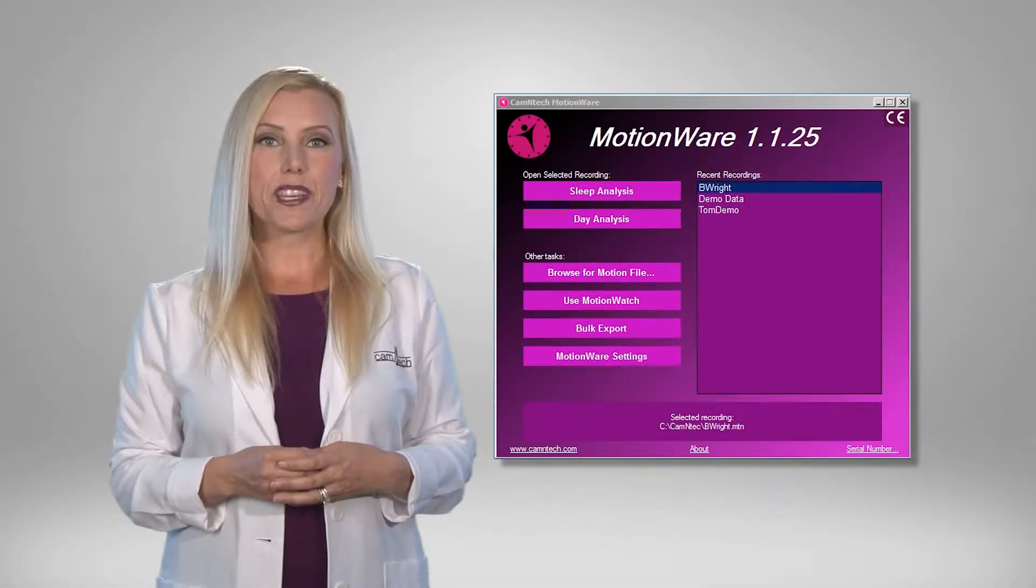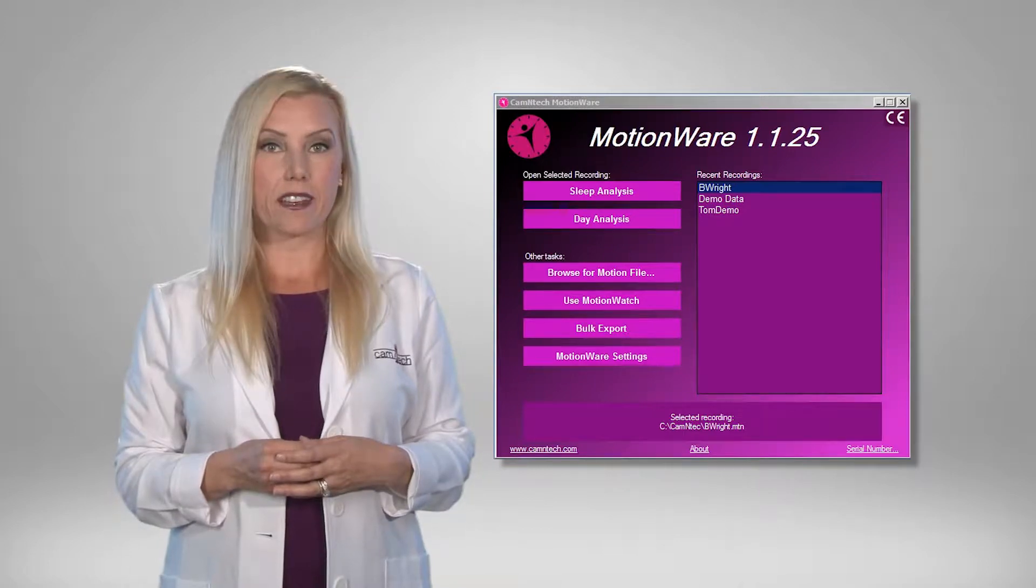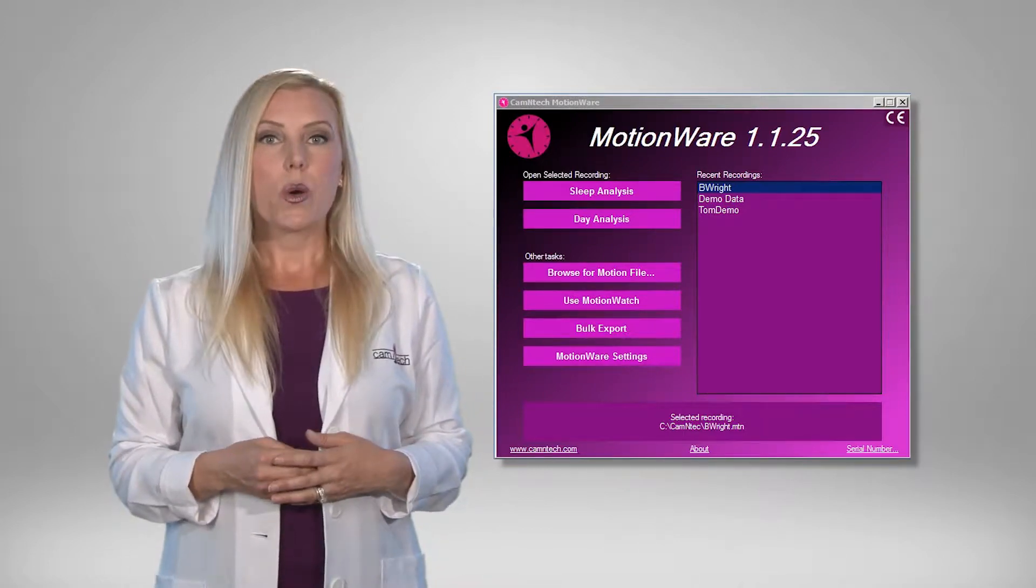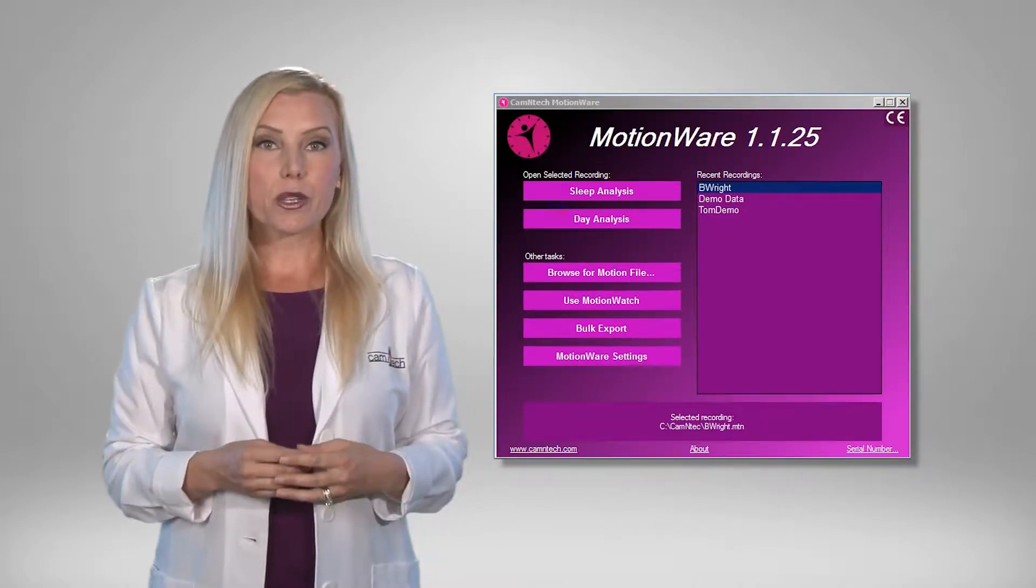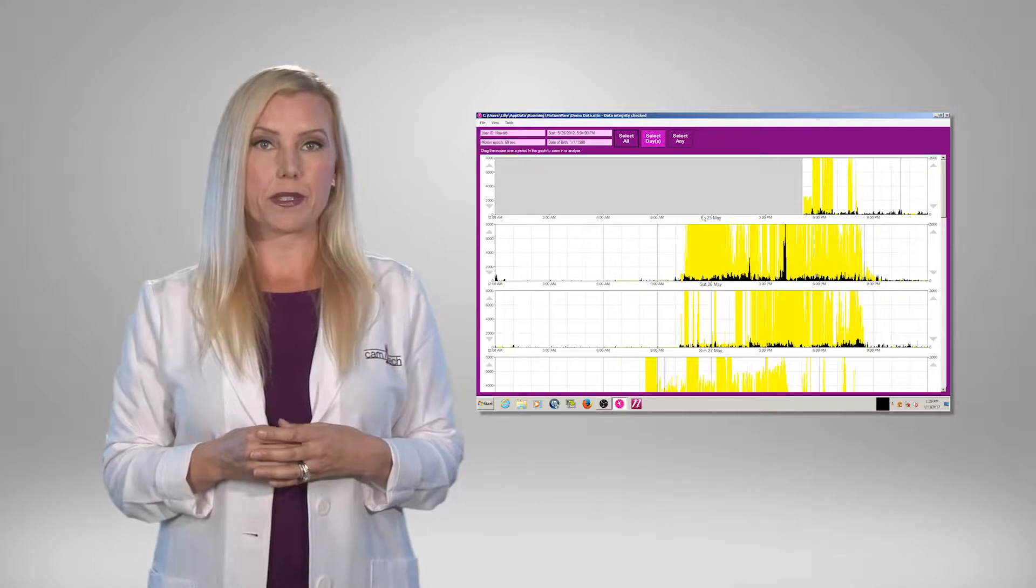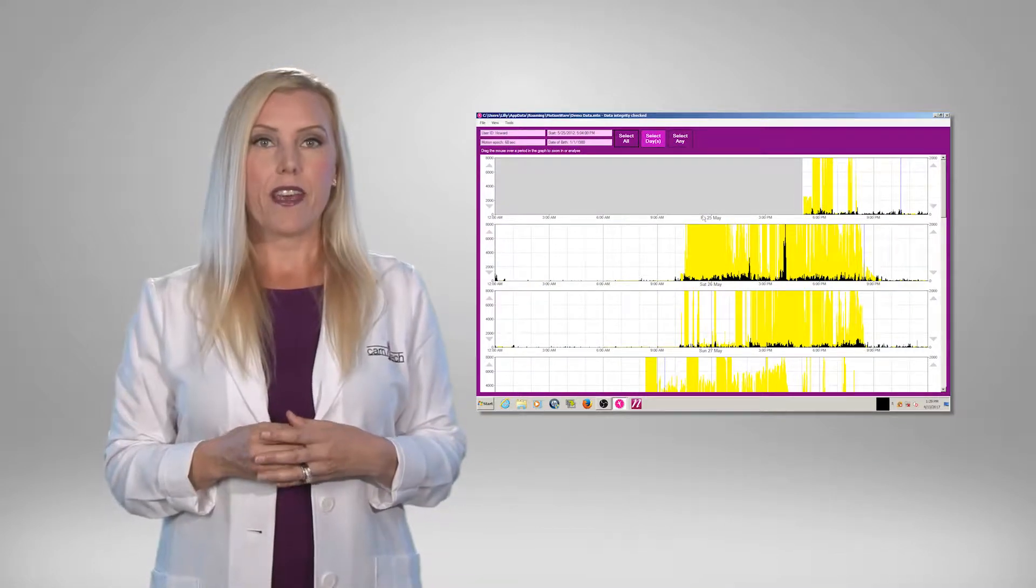Motionware offers you several tools for analyzing your recorded data. When a recording is opened, this MotionWise window is displayed.